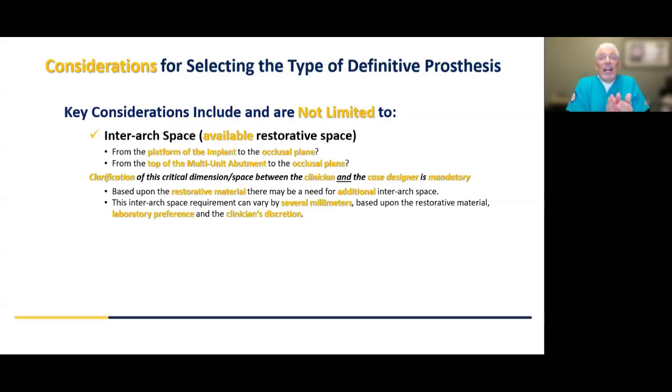Well, that's great. It's your call, doctor, but that needs to be happening before implant, before the surgery. That's all done in your go-to meetings and discussions. So there's a lot of communication going in ahead of time to make sure that at this stage of the game, there are not any surprises. If there is a surprise, it's very minimal, and hopefully it's a good surprise.